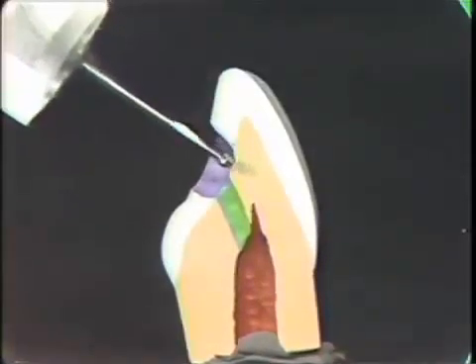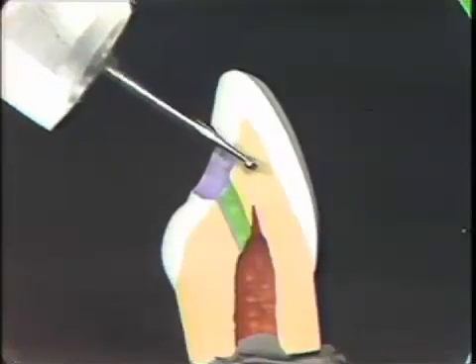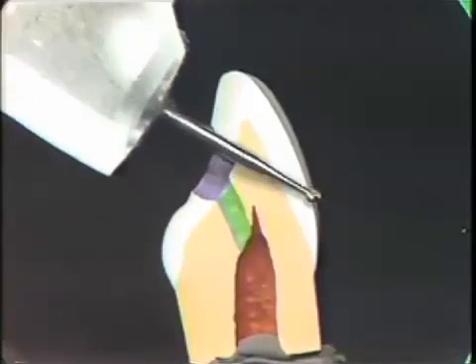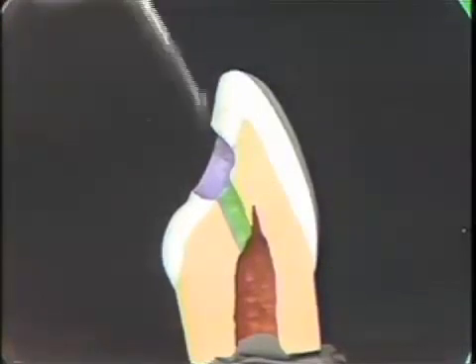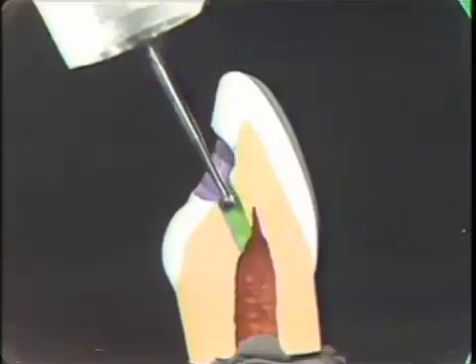They keep it in the same angle that they kept the high speed, and they continue right out, miss the pulp, and go right out the front of the tooth. Now, patients don't like you drilling holes in their teeth while you're looking for the pulp, so make sure and check your angulation so that you're in the proper long axis of the tooth and go right on down.